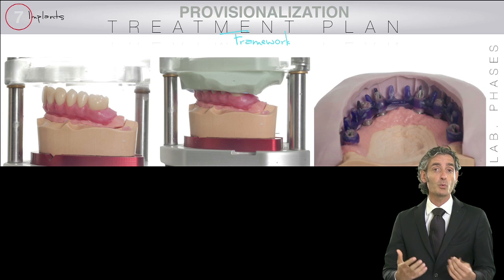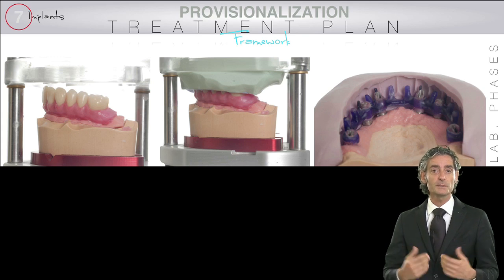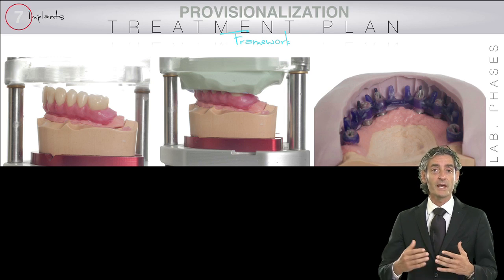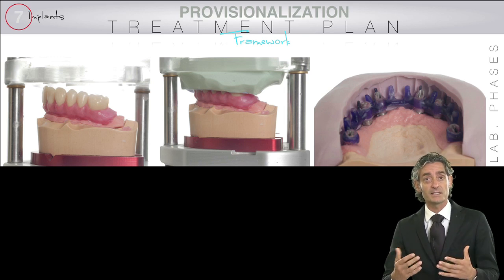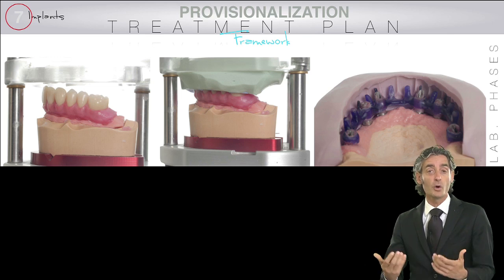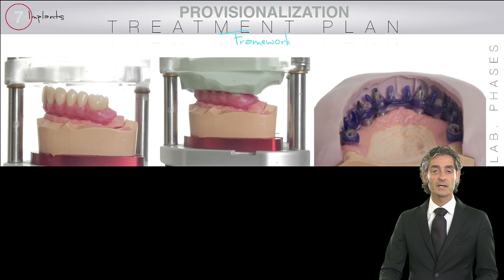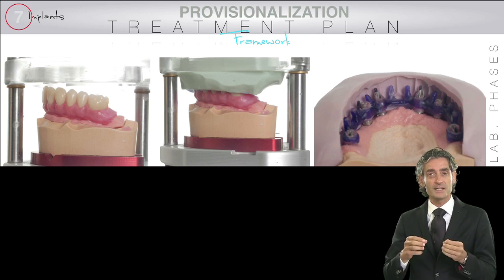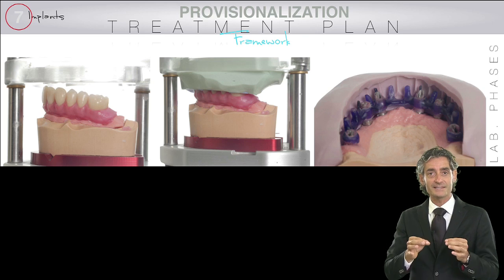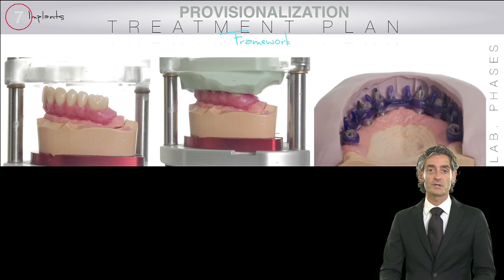Why a metal framework inside the provisional restoration? For us it's really important because in this way you can avoid any kind of fracture of the provisional restoration, and so you can avoid the risk of overloading an implant that can remain alone in the mouth after the fracture. And we will see how this framework is not fitting precisely on the provisional abutment, but has some kind of gap that gives us the freedom to set the provisional restoration in the mouth.